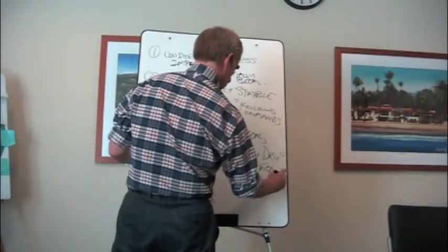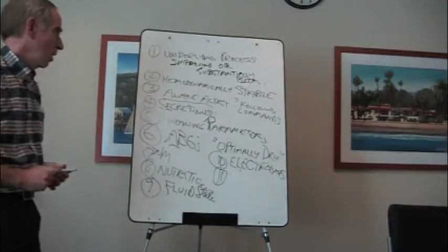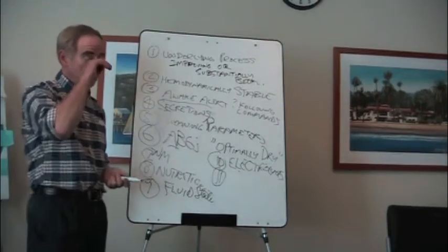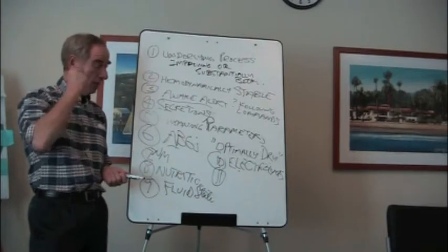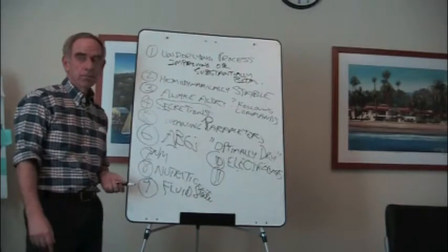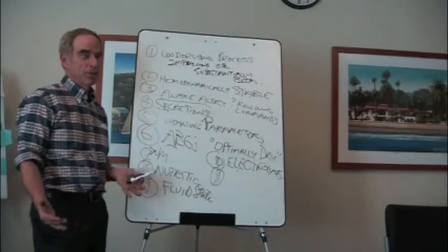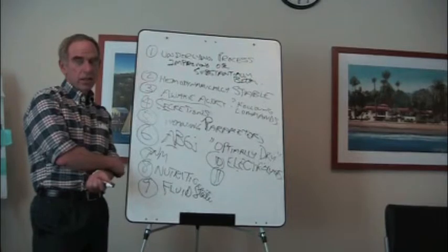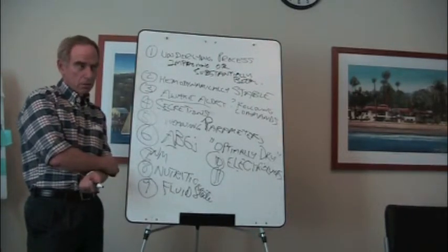I know this is kind of covered underneath the other ones, like febrile. Well, fever, I mean, we do extubate people that are septic. It does increase minute ventilation for ventilatory requirements. Yeah, if somebody's got a fever of 105 or malignant hyperthermia or serotonin syndrome or something like that, you're going to wait for them to cool down before you extubate them because it's going to increase their metabolic demand and their respiratory demands.